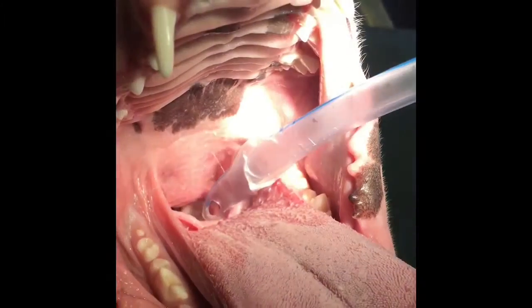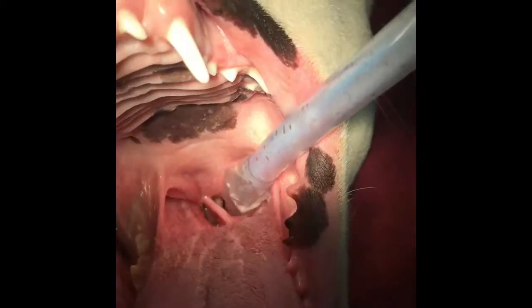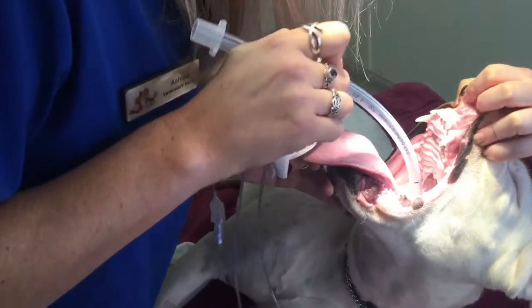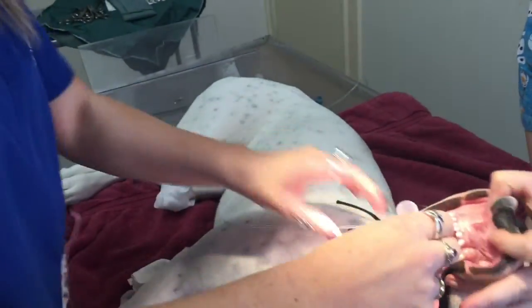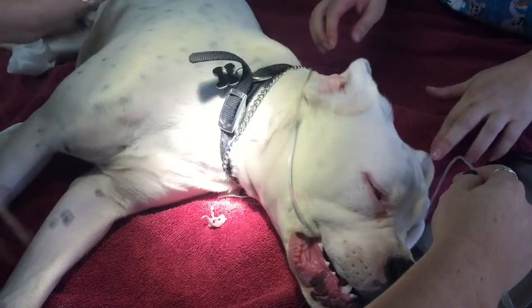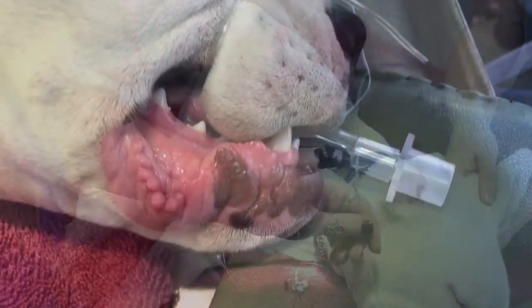I was then able to try again on a much larger patient with a bigger airway, which makes tubing them a lot easier. Alright, ready? Okay, yep. There we go. Need to make sure the tube has gone down the right pipe. That will be by checking that air is coming out after you've placed it.